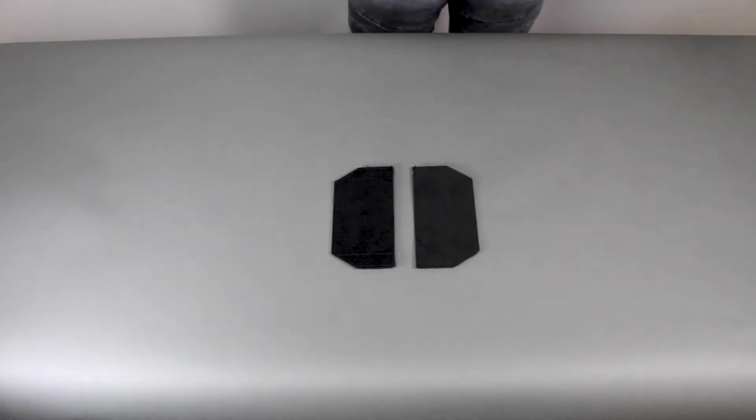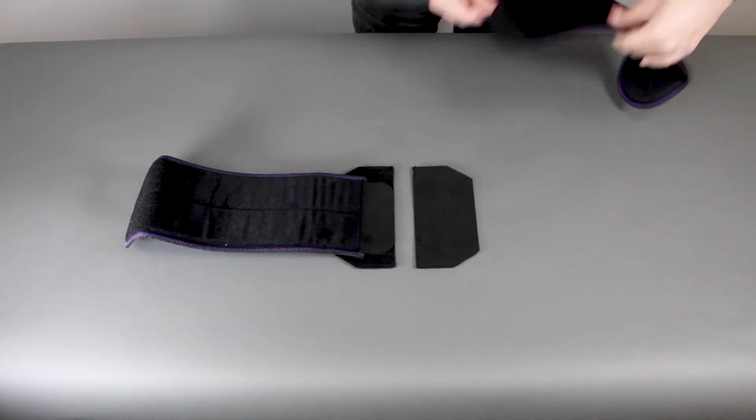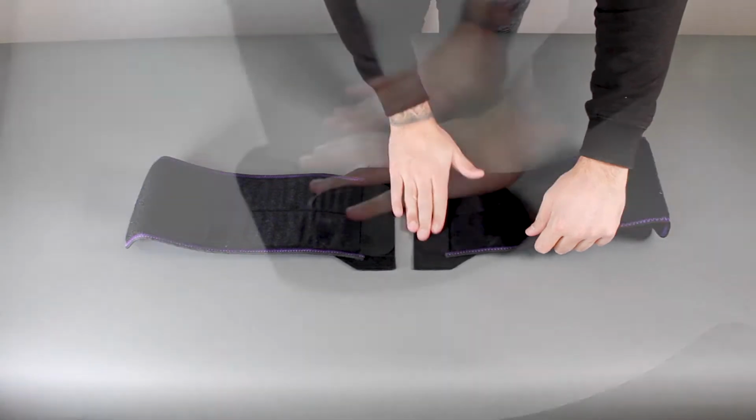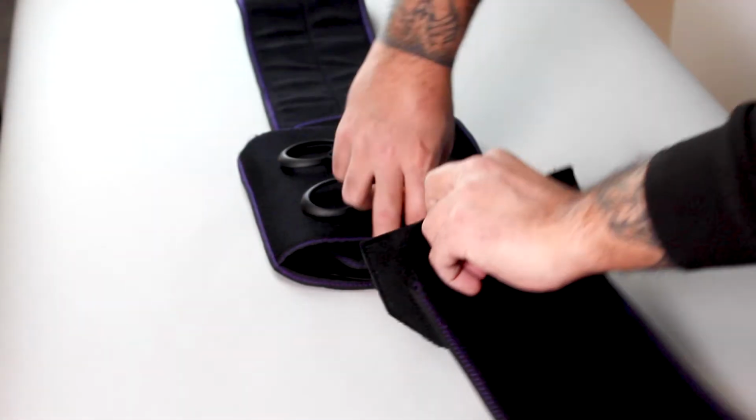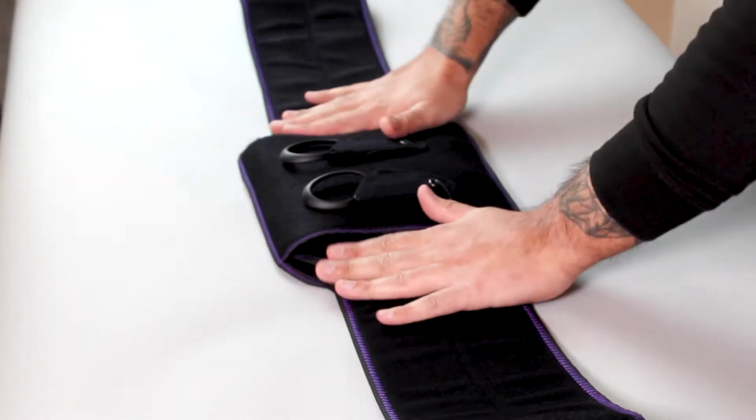Attach the belt to the adaptation piece and ensure the long edge is in line with the hook tab. Repeat this on both sides. When securing the belt, ensure the shiny side is facing up. Slide the hook tab in and secure.